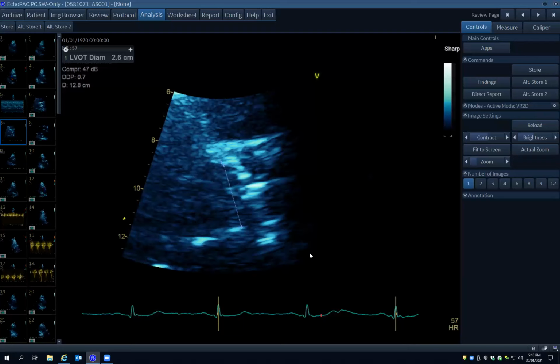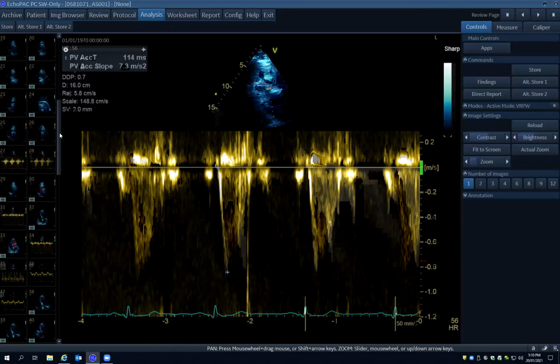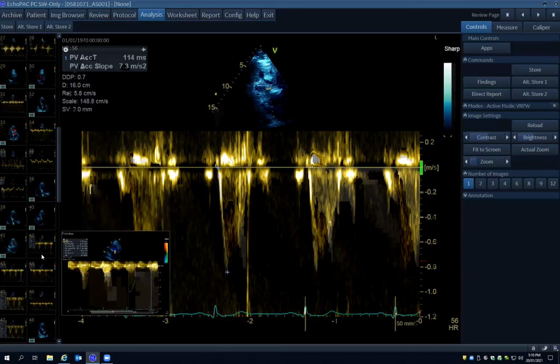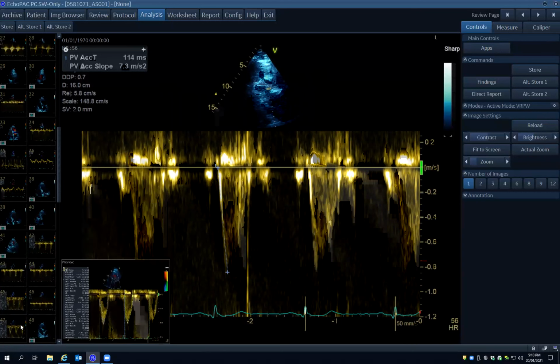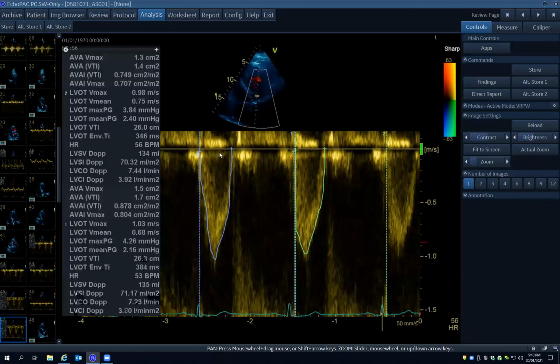Yeah. And I always thought it was like, maybe we can flip to that now. If you look at the LVOT, that is not the LVOT. If we go to the LVOT trace, we often talk about when you see that closing click. You've got to make sure you see the closing click. And again, this isn't the best image in the world, but you want to see that closing click. And for me, that's when those valves are closing. Absolutely. So the main reason I use the valve insertion points is it's an easier benchmark and it's easy to be consistent with it, basically.